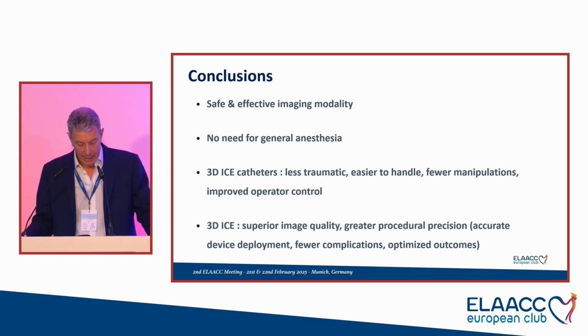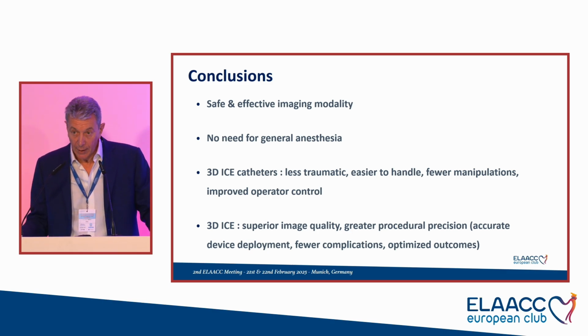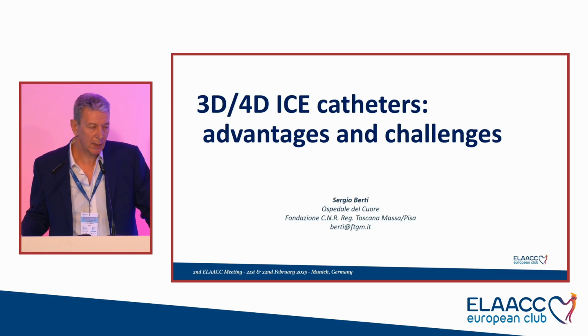With 3D ICE the quality of the imaging is superior, for a greater procedural precision, for an accurate device deployment, to reduce the rate of complications and to optimize the outcome of the procedure. Thanks so much for your attention.